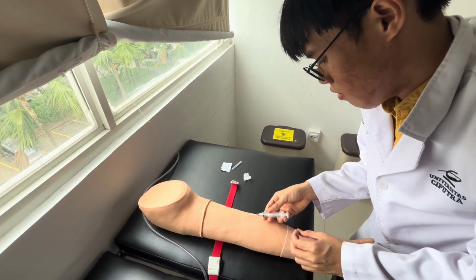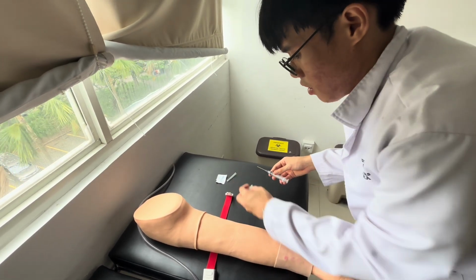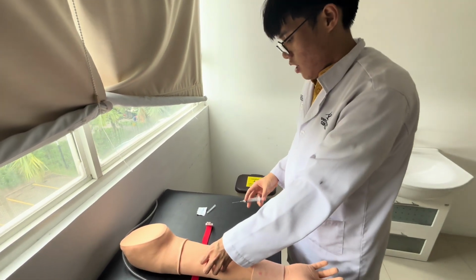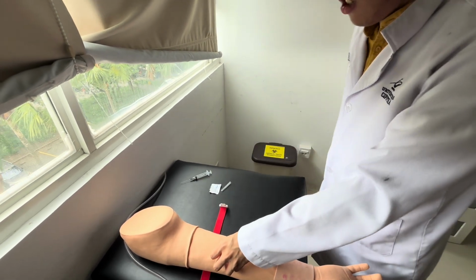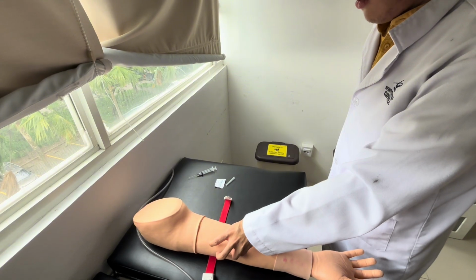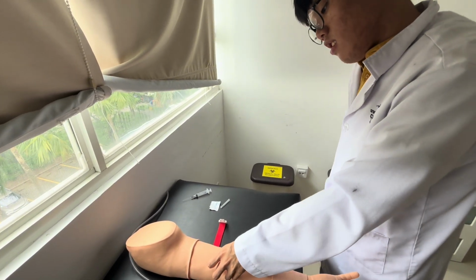And then after the medicine is administered, take it out, and then apply pressure to the punctured spot. The syringe, you will dispose of in the medical bin. So there you go. And then you apply pressure to the wound for 2 to 5 minutes, or you can ask the patient to apply it too if you want to do that.